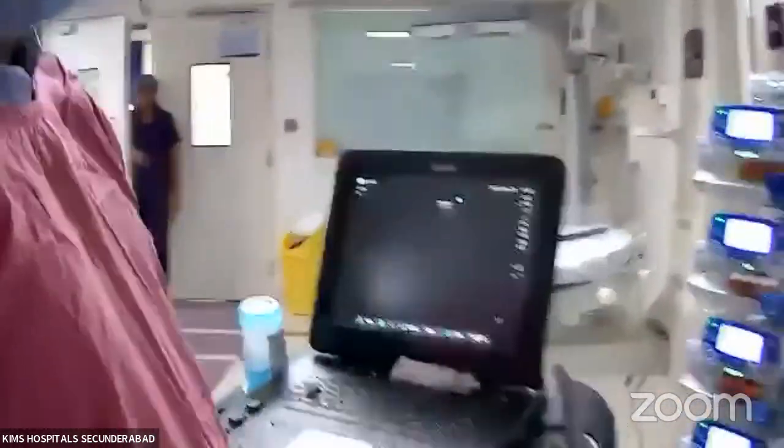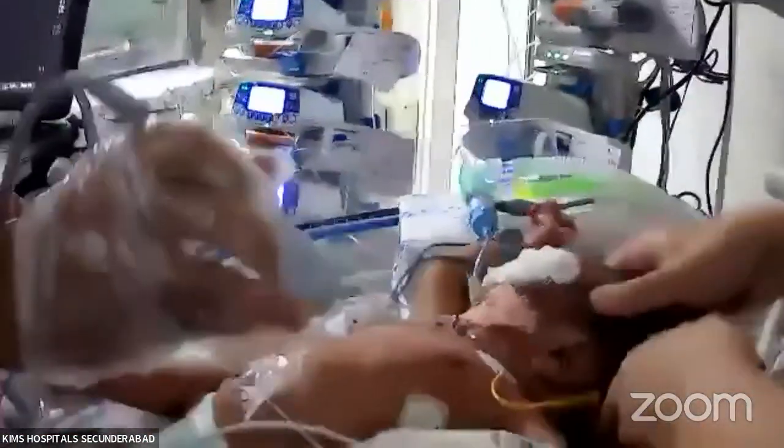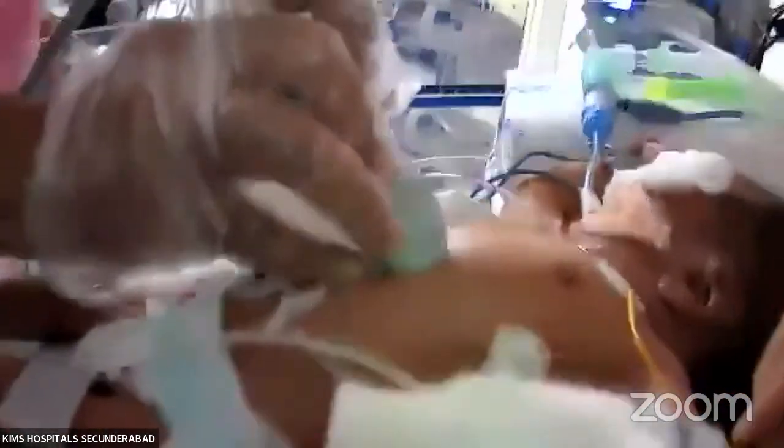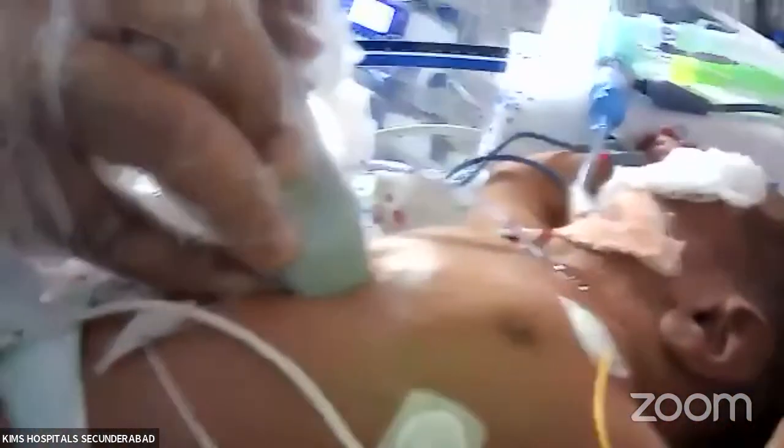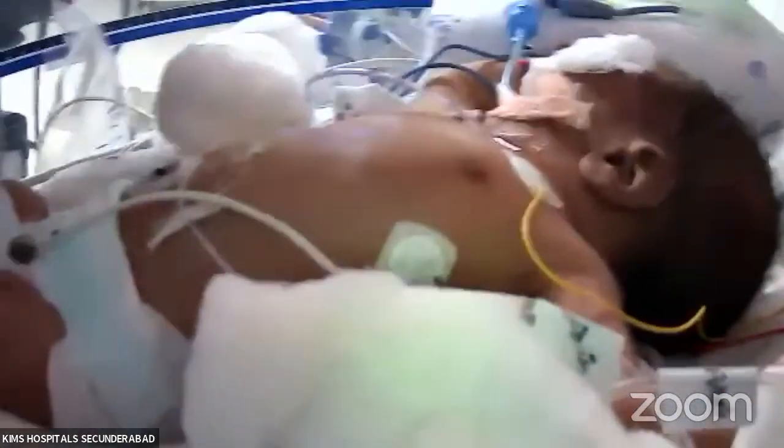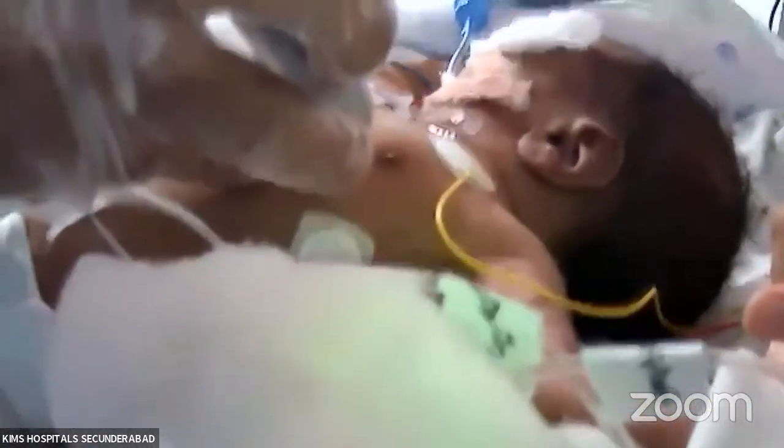So now you saw, and now come here. I'll show from the beginning. This is the subcostal. You will see the IVC. Go towards the left, you will see the aorta. Come towards the right side, you will see the IVC, left side towards the aorta. Apex, the marker should be on the left shoulder. Like this is a 4-chamber view.